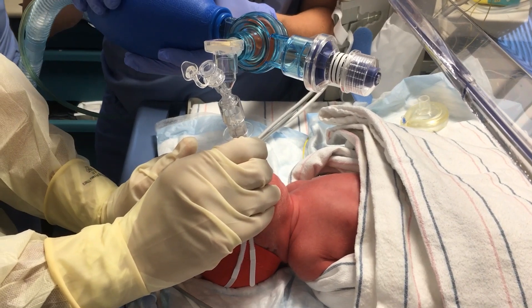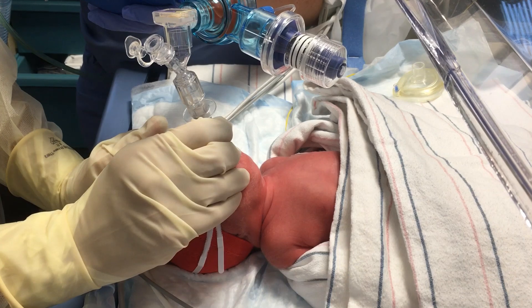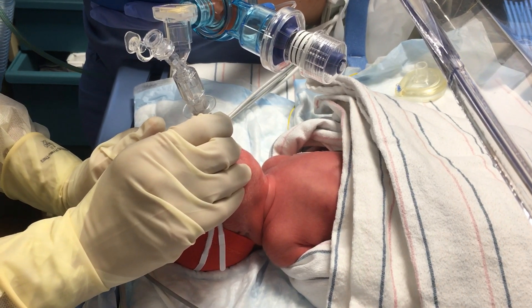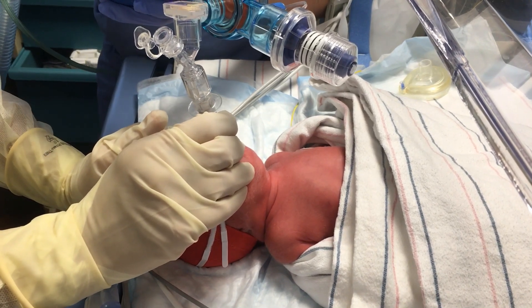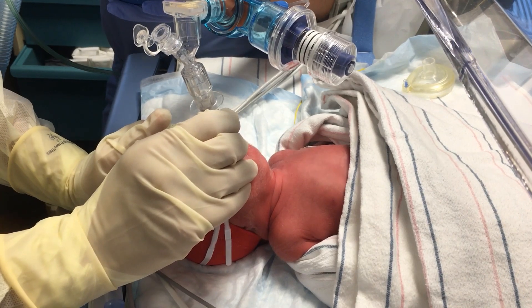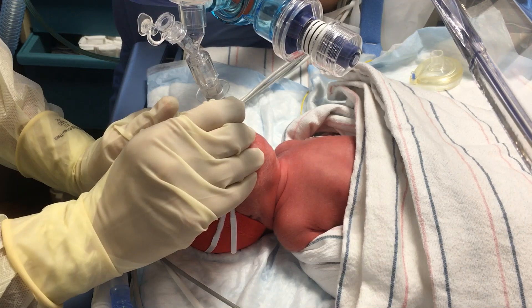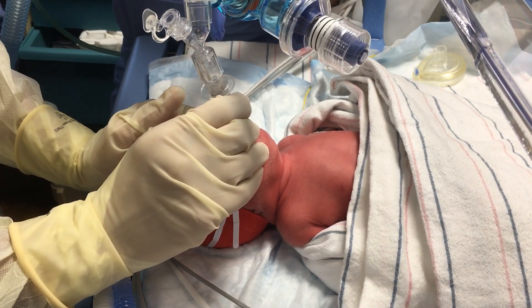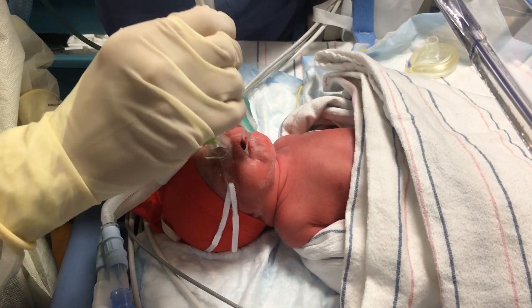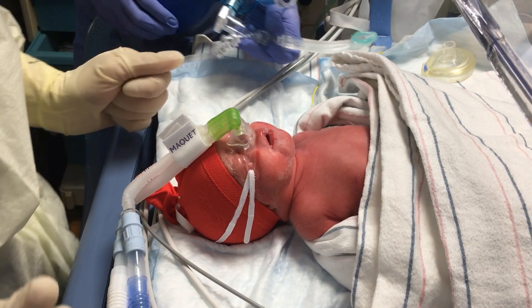Saturations are 100, and then when we're done we'll just take it out and then put the OG back in and aspirate to see if there's any surfactant in the stomach. All right, what do you think, baby? Let's see if Papa's back on.